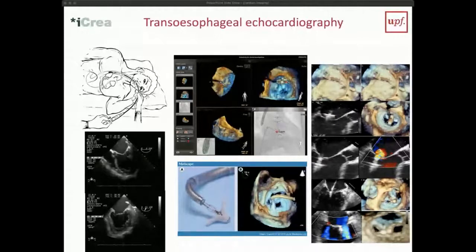But one of the things that we said before is that ultrasound also has some disadvantages, especially transthoracic ultrasound, where we have to go through the thorax to do the imaging. What we said is that you need to go in between the ribs, and so you might have quite a lot of artifacts. And you can also only do specific sector imaging with quite some limitations. So you cannot easily look at all sides of the heart.